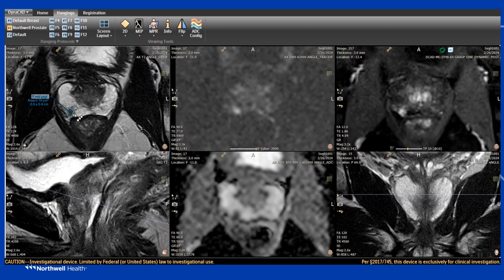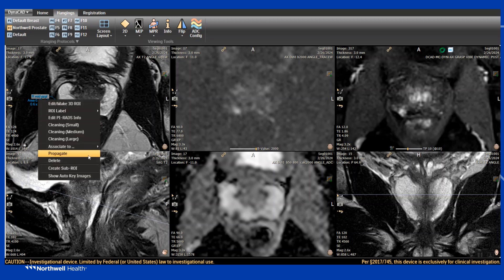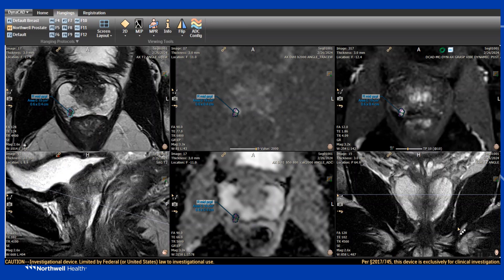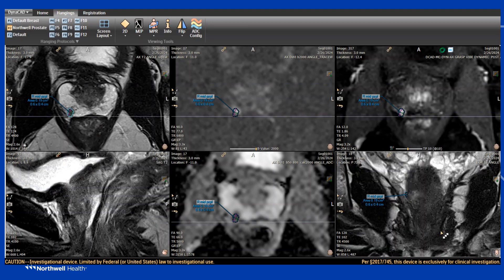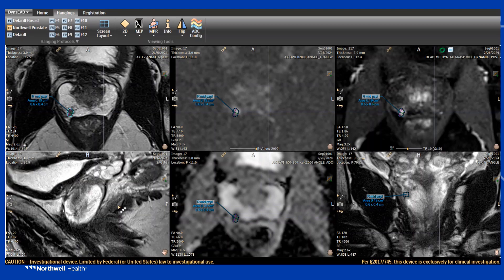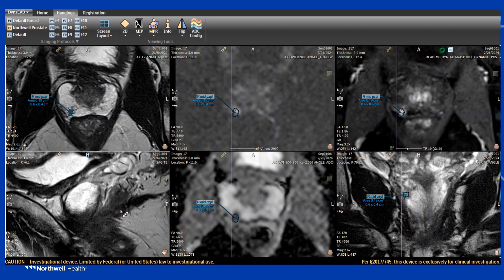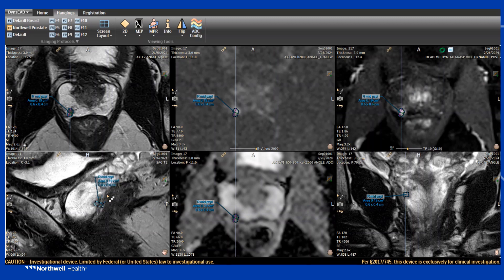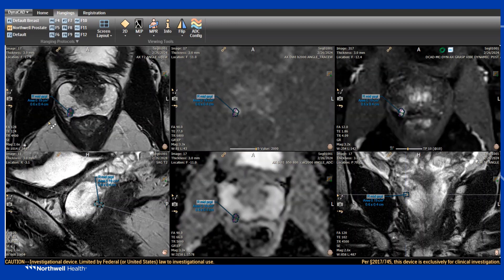It's on one slice and we have a lesion. If you're new to this and want to verify it lines up well, right-click and click propagate — it'll show you the same spot across all correlated scans. The challenge is that we use the T2, the upper left, for the biopsy, but the other information helps us really see what's going on and make an assessment.